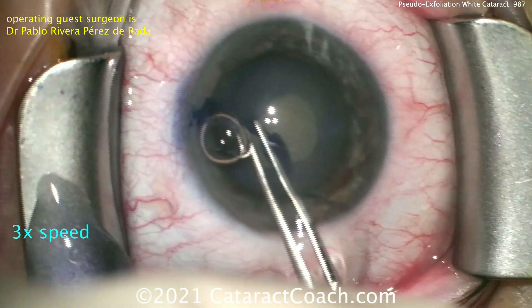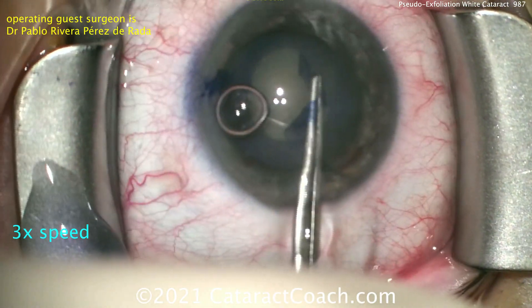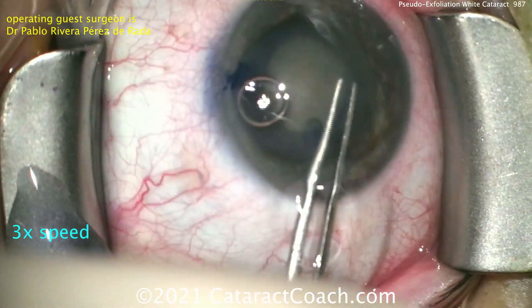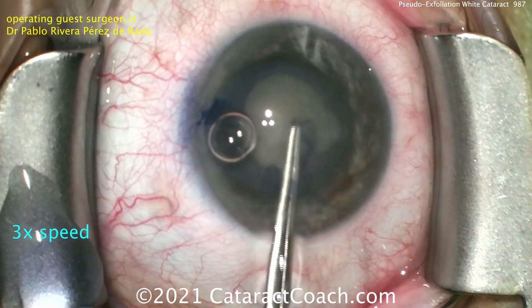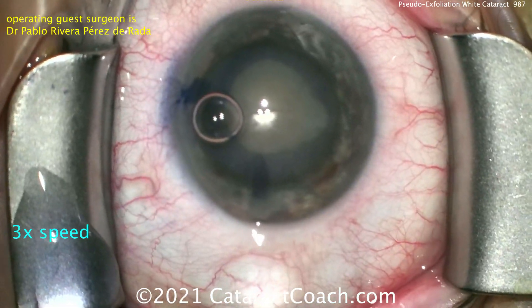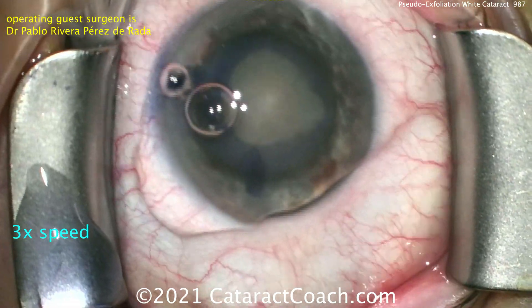This video is going to be shown at 3 times normal speed, so I can show you the whole video from start to finish. Notice that capsulorhexis is a very appropriate size, and enlarging it here a little bit at the end. It's okay if it goes out a little bit like this — that's not going to cause any issues, as long as it's continuous, which it is.